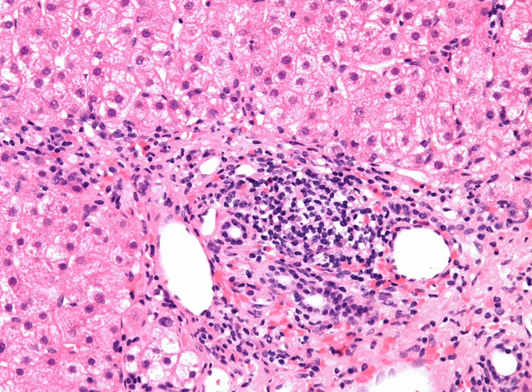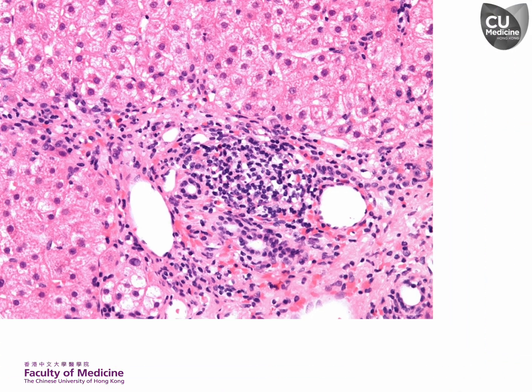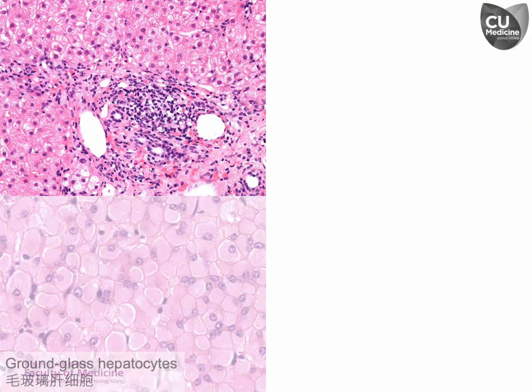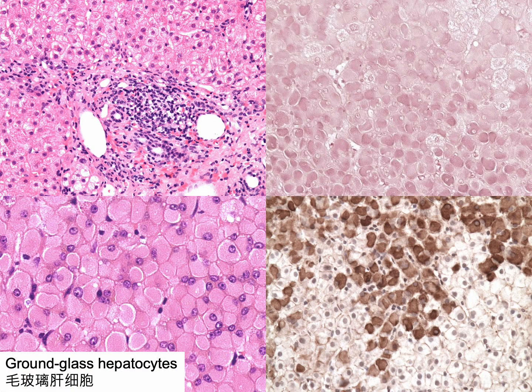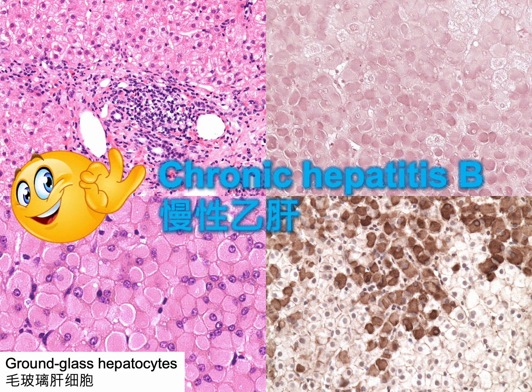The portal tract in this example shows mild lymphocyte predominant inflammation. If we identify ground glass hepatocytes, which might be further confirmed by Orcein stain or immunohistochemistry for hepatitis B surface antigen, we could establish a definite diagnosis of chronic hepatitis B.